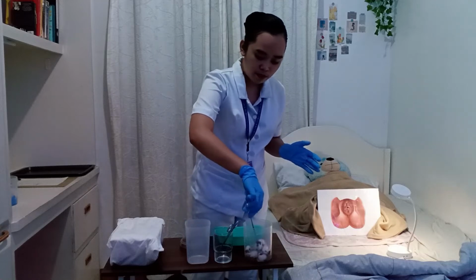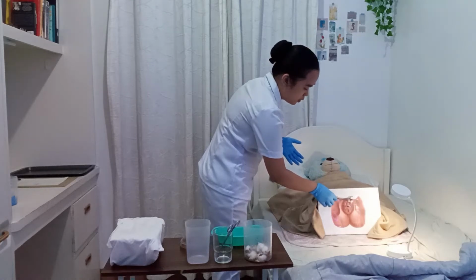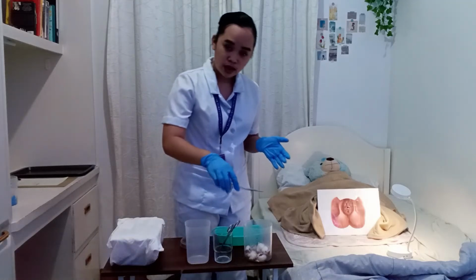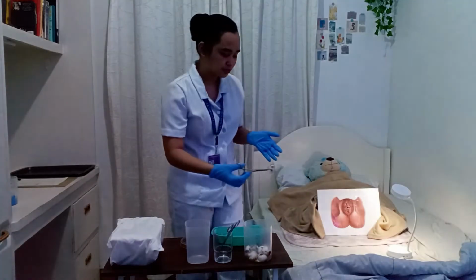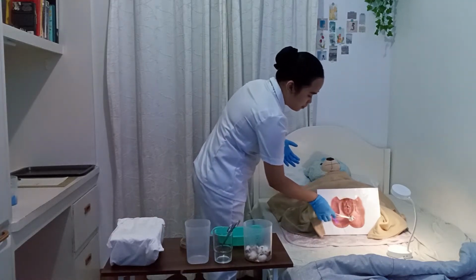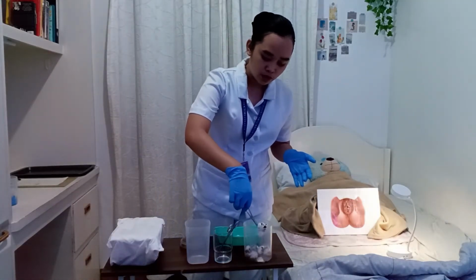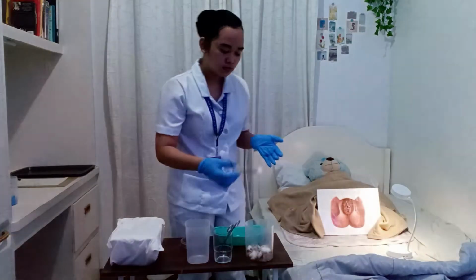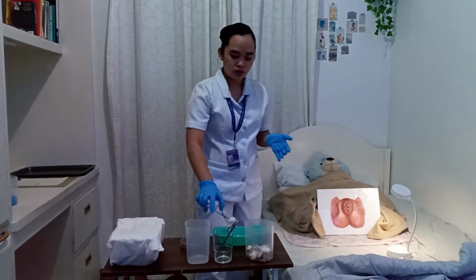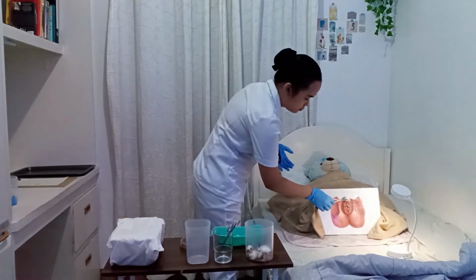And now, for the labia minora, we're going to start at the mons pubis, figure of 7, down towards the labia minora, towards the anus, and then discard. And do likewise on the other side. Mons pubis, figure of 7, down towards the labia minora, towards the anus, and then discard. And now for the labia majora. Mons pubis down towards the labia majora, towards the anus, and then discard. And do likewise on the other side.